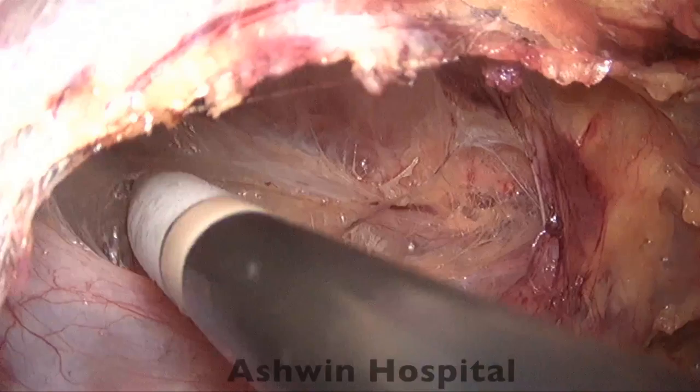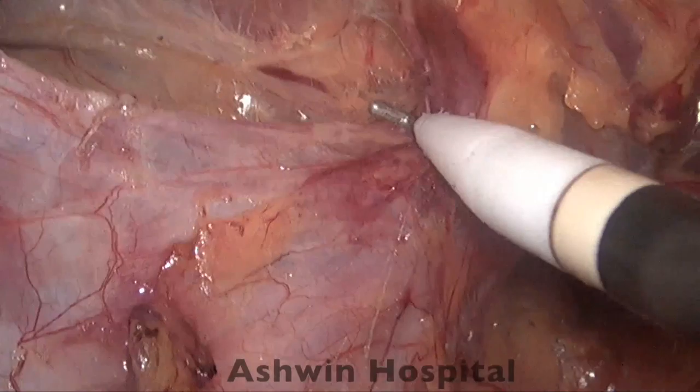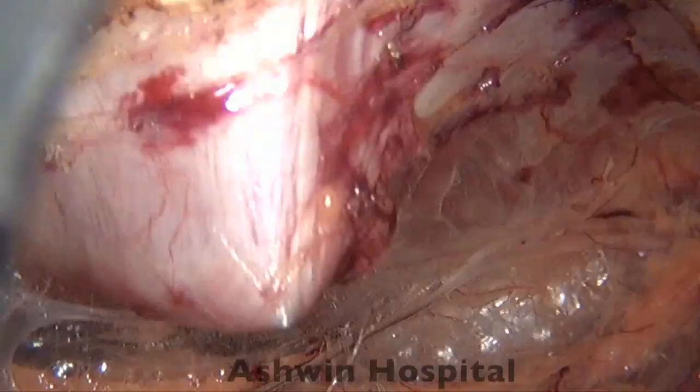So here, because the planes were very clearly visible and we didn't have too much difficulty, we're still continuing to dissect, and you can see already the Bogros space has been dissected quite well, and you can see a nice dissected space available. So that is the area of the peritoneum.